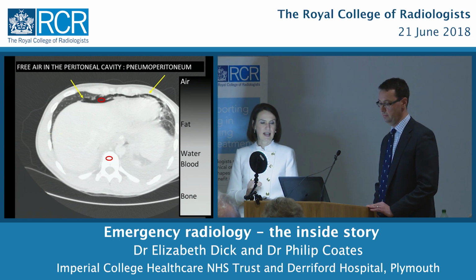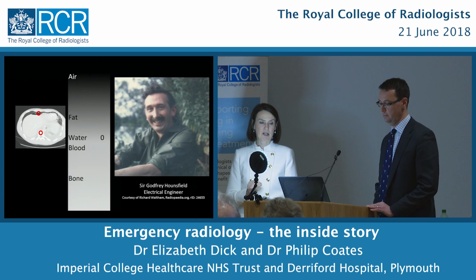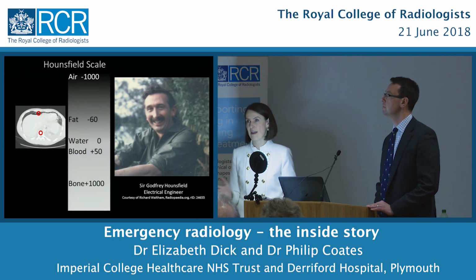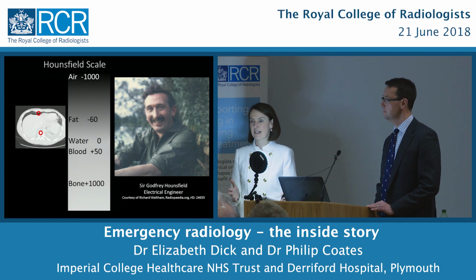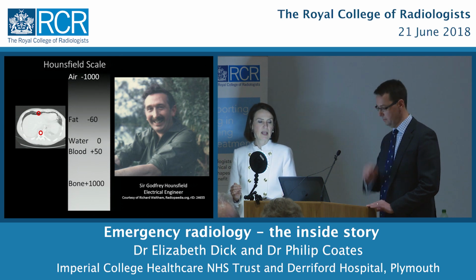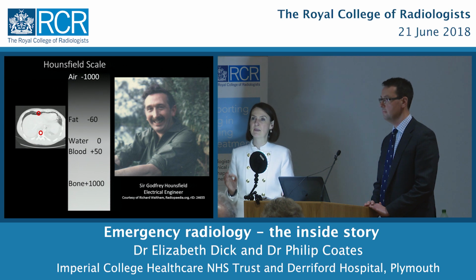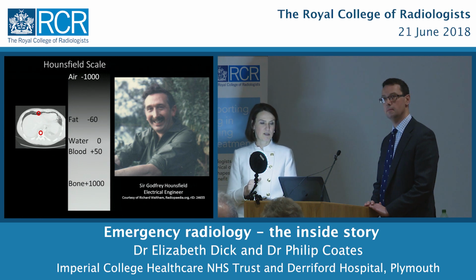So this grayscale is named after Sir Godfrey Hounsfield, and Sir Godfrey Hounsfield is one of every radiologist's heroes. He was an electrical engineer who basically invented CT, and in honour of that, the grayscale is named after him. And if I measure the density of bone or the density of air in any patient, in any hospital, anywhere in the world, I will always get the same number. And that is the beauty of the Hounsfield scale. And as we go through the next hour, you'll be seeing that we use it a lot.